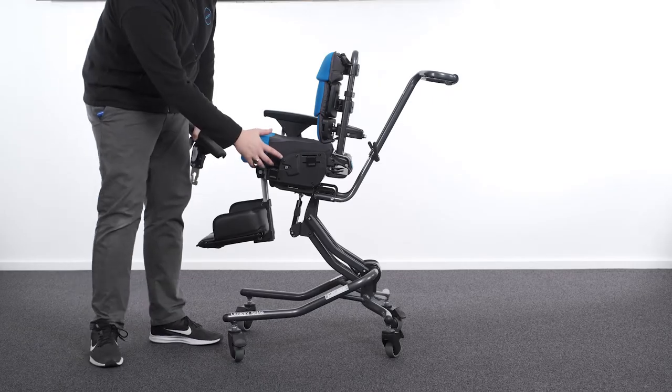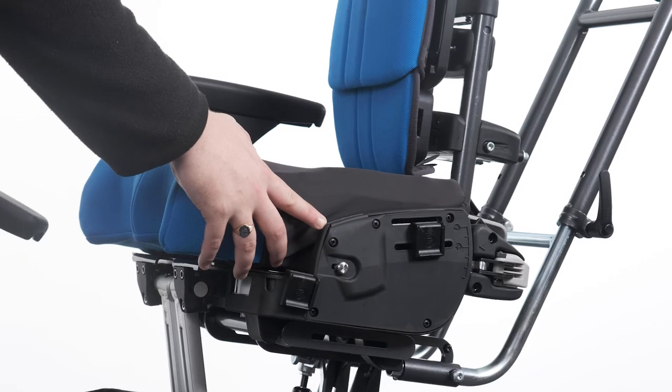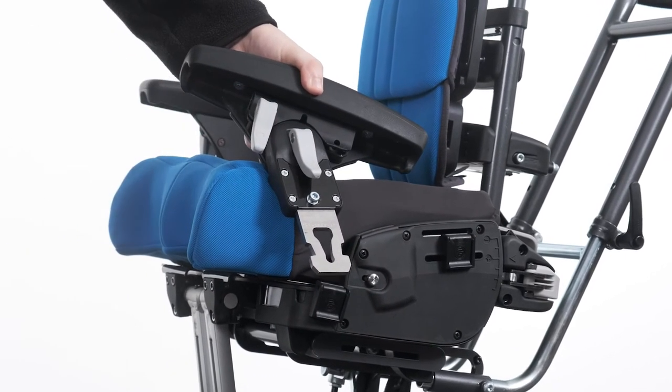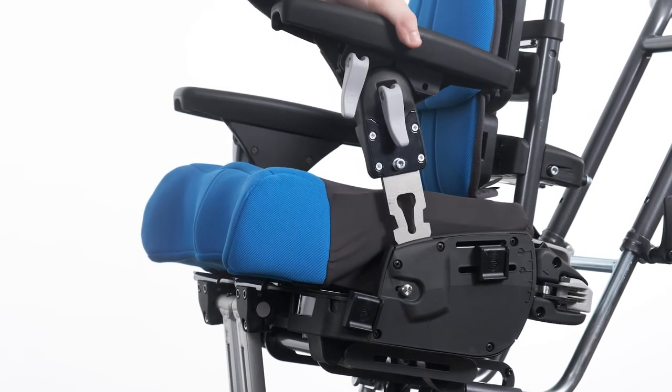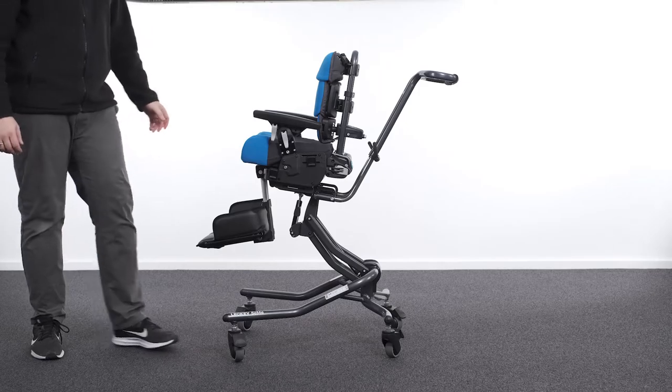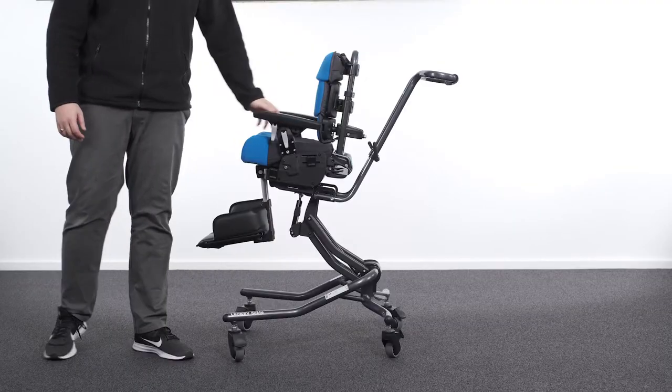Attaching the armrest. To attach the armrest, locate the slot on the sides of the seat base and orientate the armrest with the adjustment cam levers facing outwards. Place the armrest stem into the slot and push downwards. Check that the armrest is self-locked by pulling upwards on the armrest.